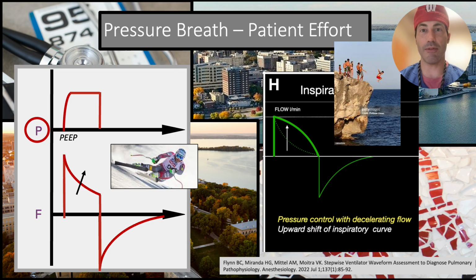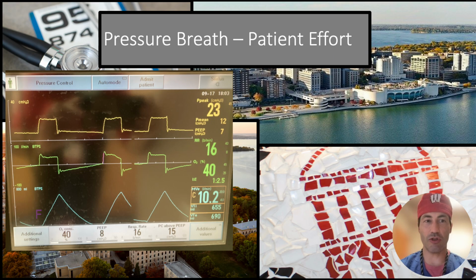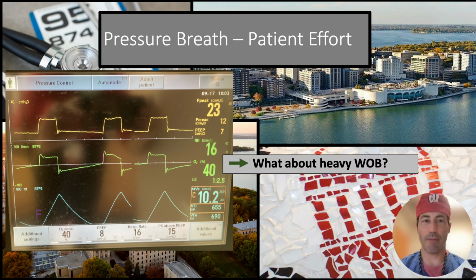Let's show an example of that on a patient. Here we go. We have pressure control ventilation. The pressure waveform sure looks like a textbook, but I notice that the flow waveform does not. We have a flow, but it doesn't decelerate. It's sustained inspiratory effort, and we jump off a cliff.